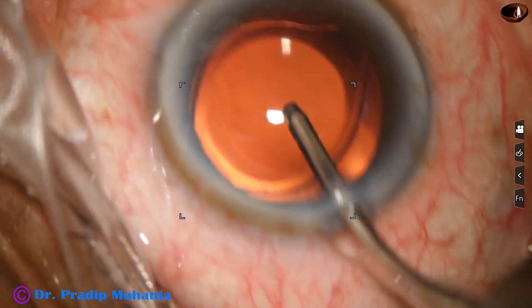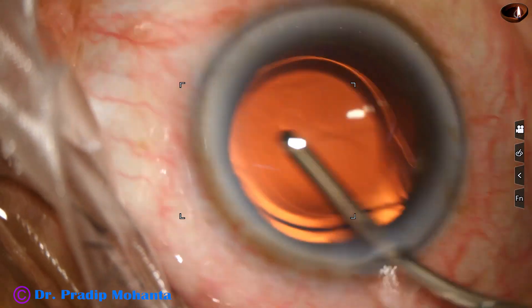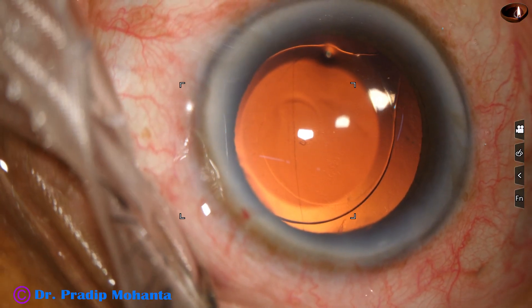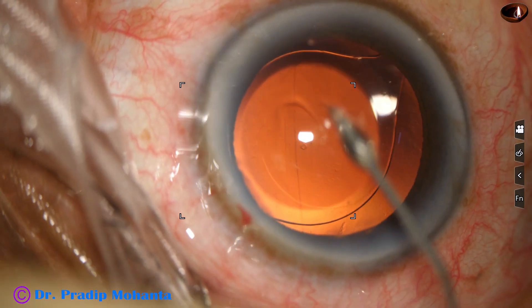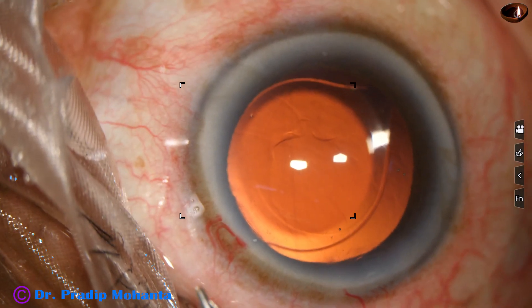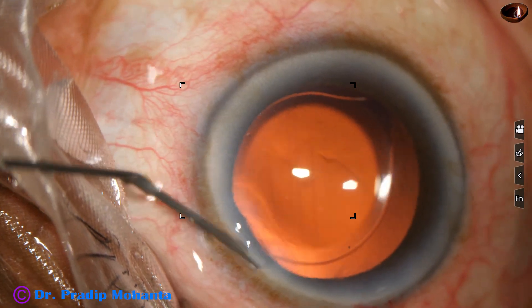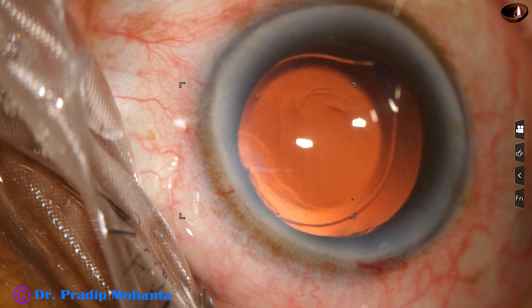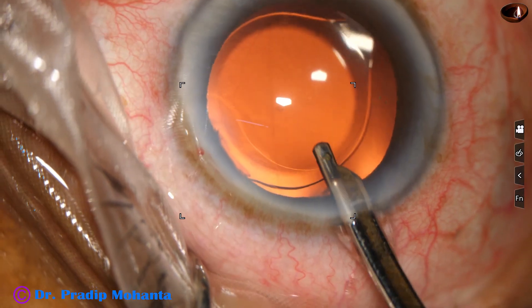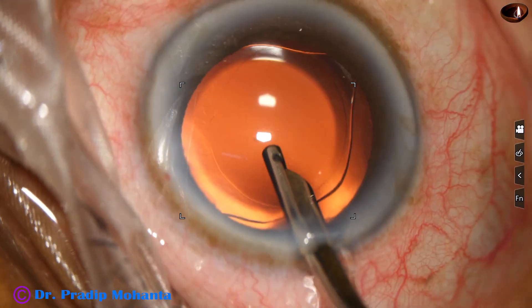Hydroimplantation of a single-piece monofocal lens has been done — hydroimplantation. This is removal of viscoelastic that was in the lumen of the cartridge. A bit of moxifloxacin is injected into the anterior chamber. Now the side port is closed by hydrating the corneal stroma on either side of the stab incision. A final lavage of the anterior chamber with the Simcoe is performed, with a gentle stream of BSS directed towards the corneal endothelium through the aspirating port of the Simcoe.